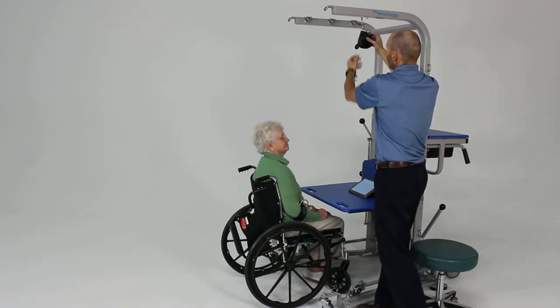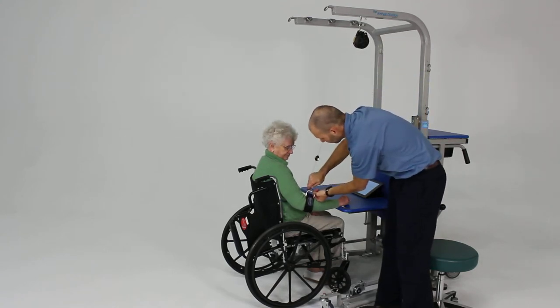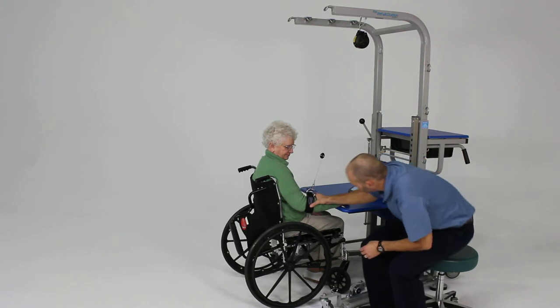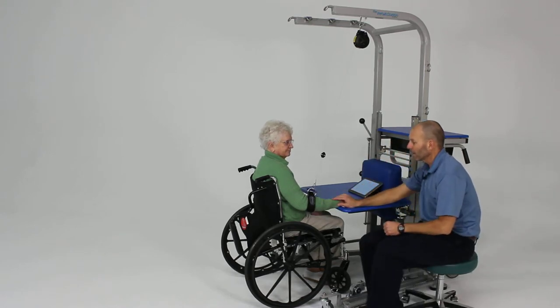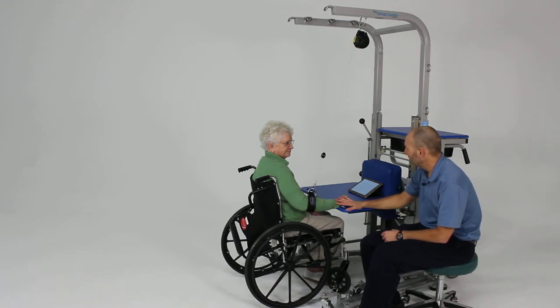We're going to crank that up a little bit and come down and attach this to our arm band or strap attached to the upper part of the forearm near the elbow joint, which seems to work well for this. Now we're going to have our patient do some activities with some assistance of the arm.